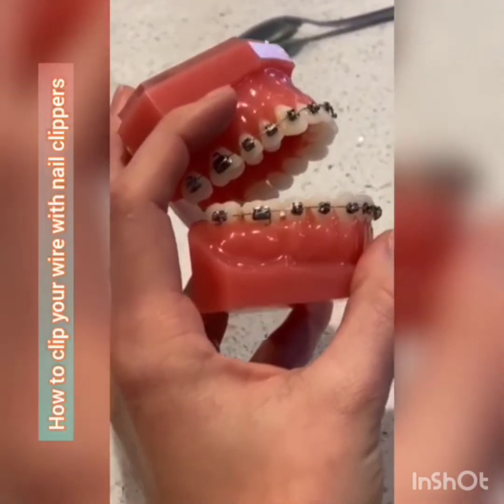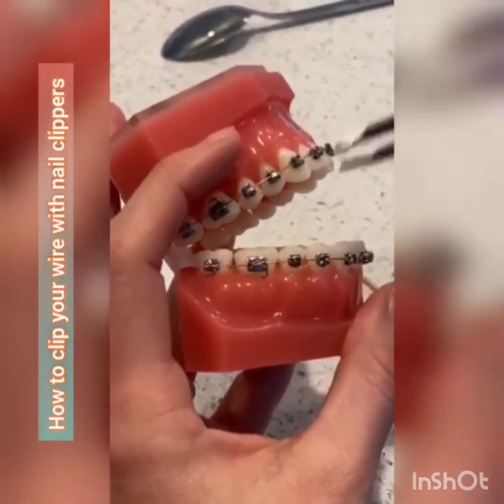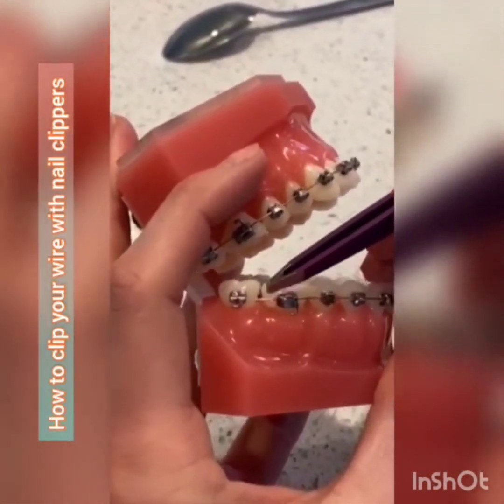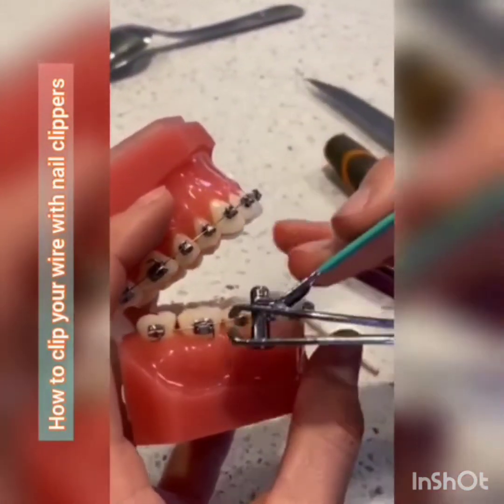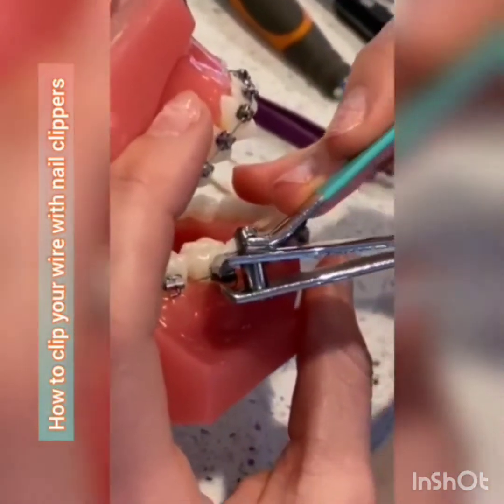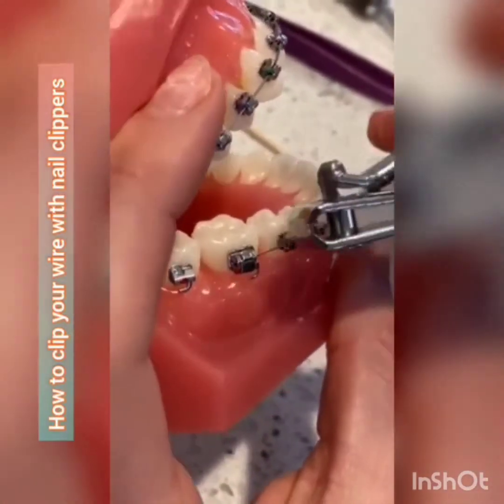Alrighty, so a very common problem to have is that your wire in the back is either short or kind of bent out of that last bracket. So what you're going to do is take nail clippers, very simple. You're going to try to get it as close as you can to that last bracket. You're going to snip like so.